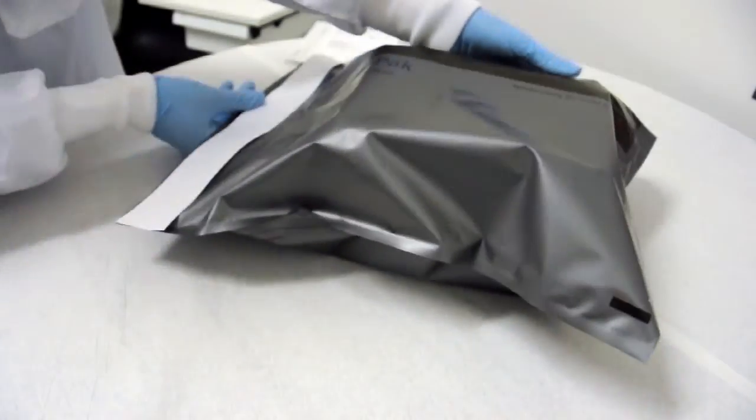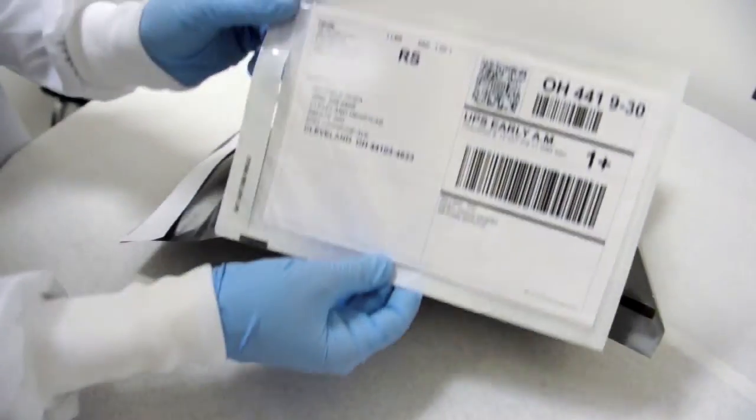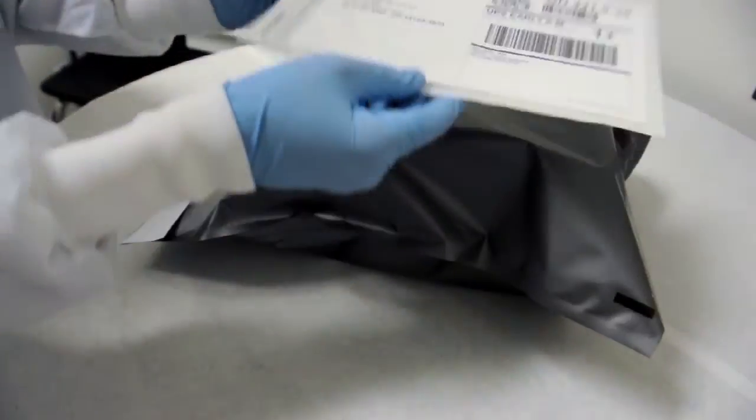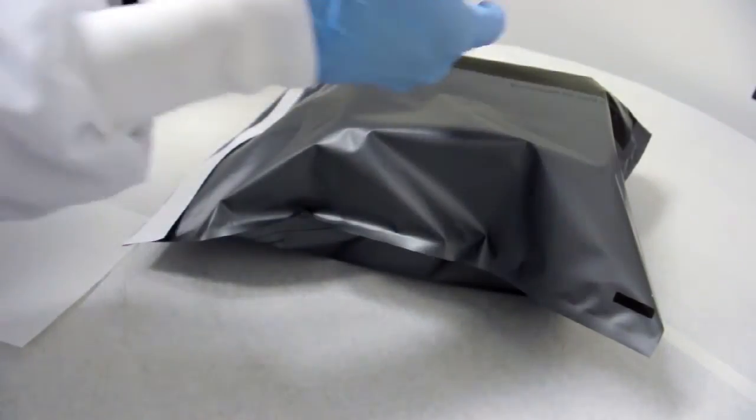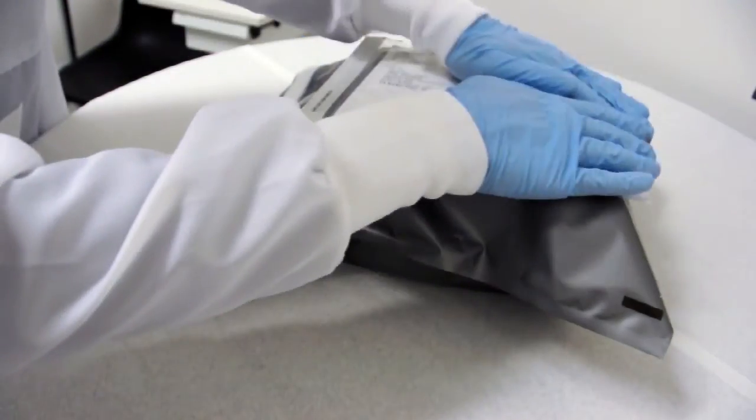Once sealed, place the prepaid shipping label onto the outer shipping bag. Write down the tracking number for your records.